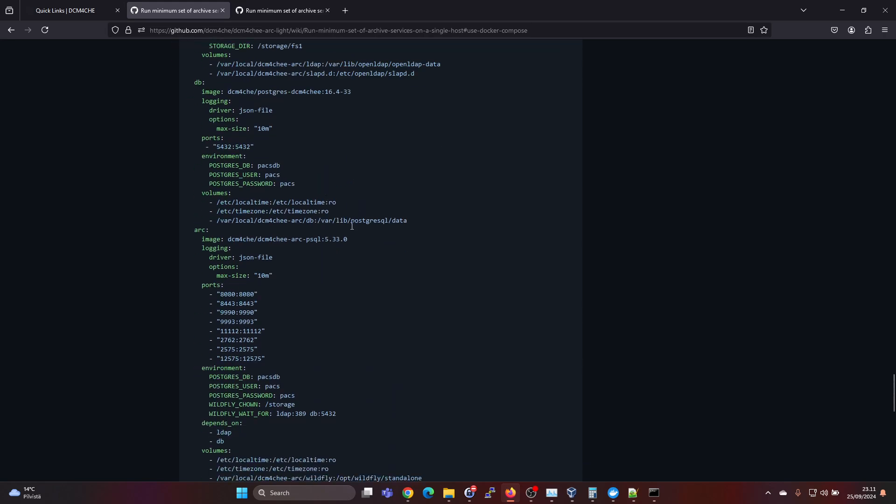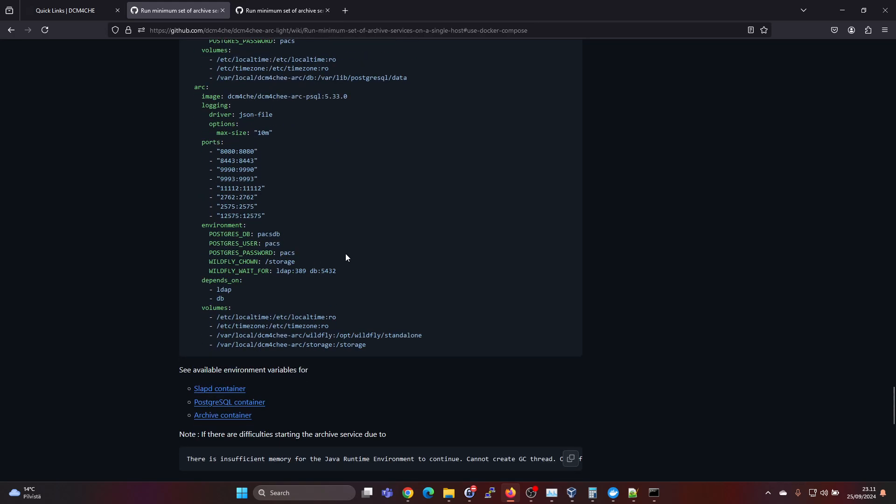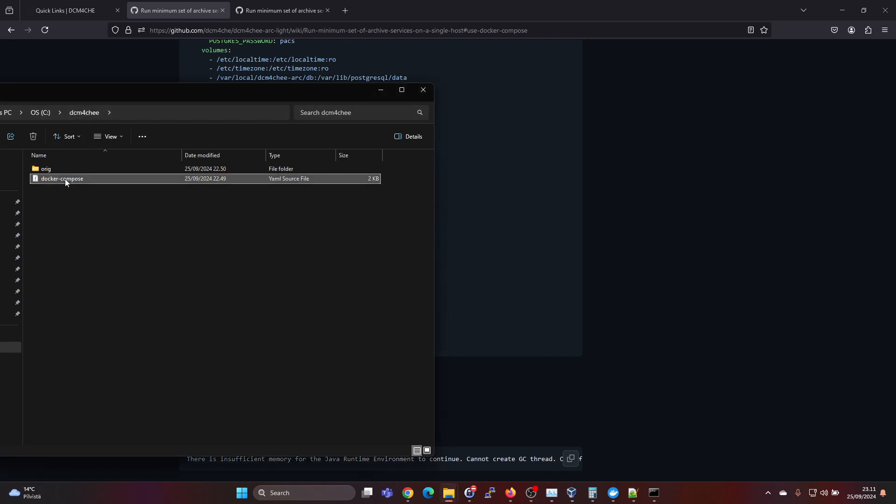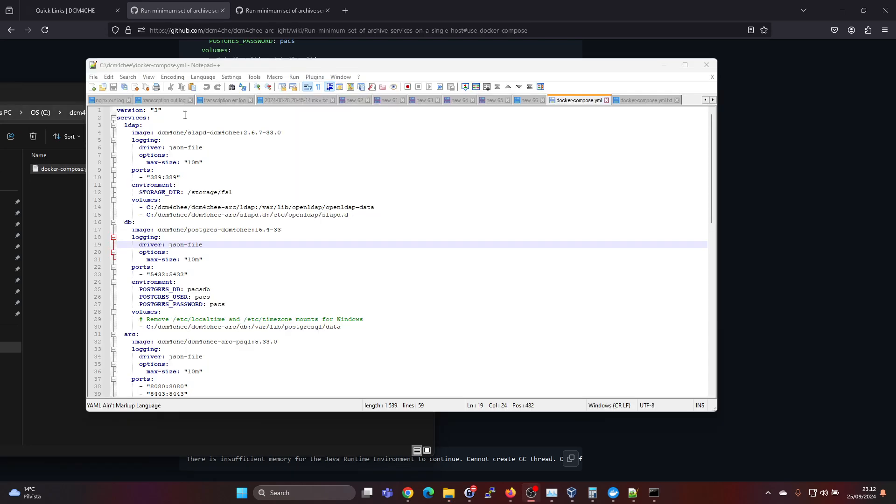And we will also have a quick look at what are the differences. So you can go ahead and on the C drive, create a folder, for example, dcm4chee and create the Docker compose file here and make sure you don't have .txt or something like that. So it needs to be .yaml. So like this Docker compose .yml.